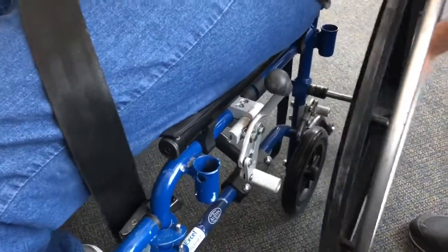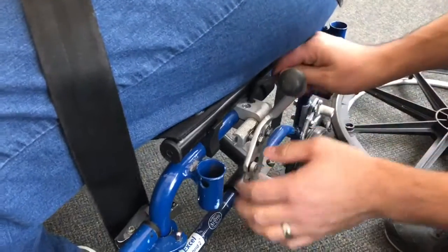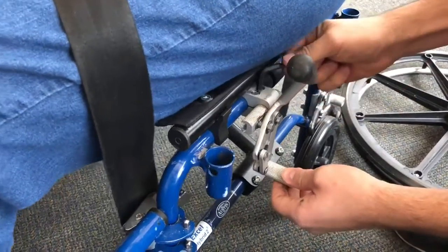tighten it down. So now I'm taking these and I'm just going to tighten them up. Good. Get a really good sit.